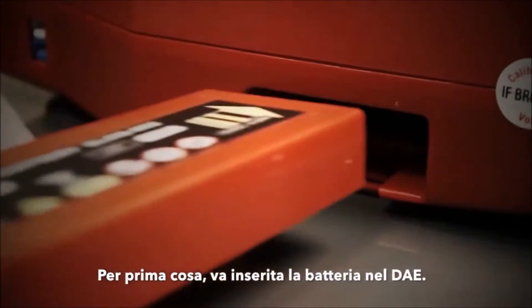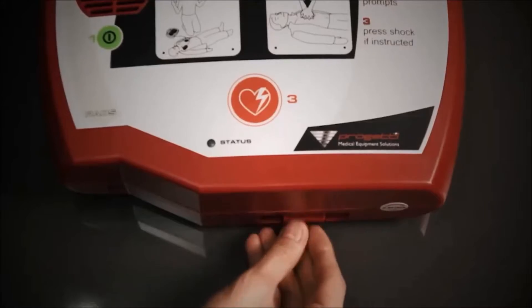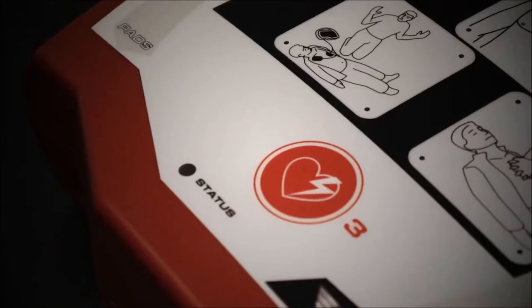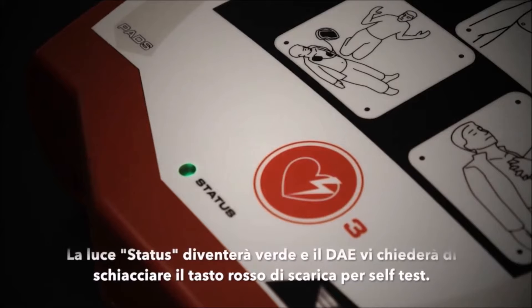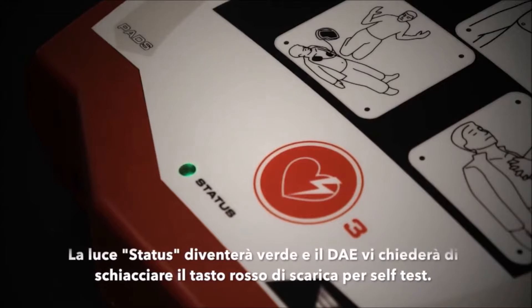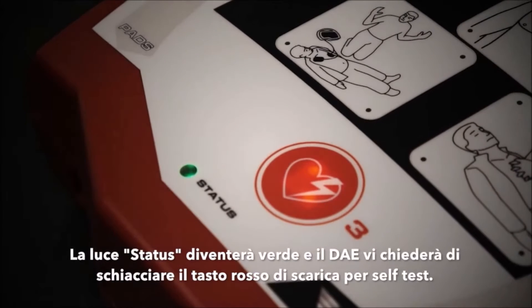When the Rescue Sam arrives, setting up the machine is easy. Simply insert the battery into the base of the defibrillator. The status indicator will light up green and a voice prompt will ask you to press the red shock button to complete a self-test: 'Self-test — press the red shock button.'